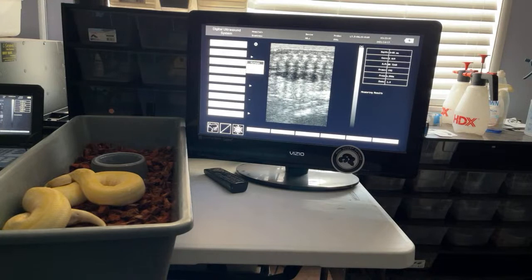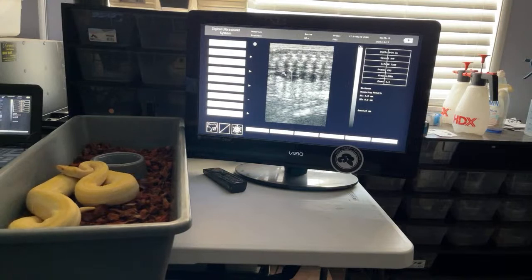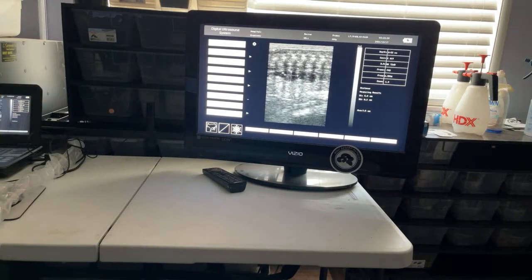Alright, we got something here. Look at this big one right here. Boom, boom. So they're starting to grow this season. Since the male I'm using for this project isn't too overwhelmed this season, he's pretty much done. I might stick him in there with her tonight. Too, so 8 millimeters. At this point in the year, I'll just be happy with actual follicle growth.